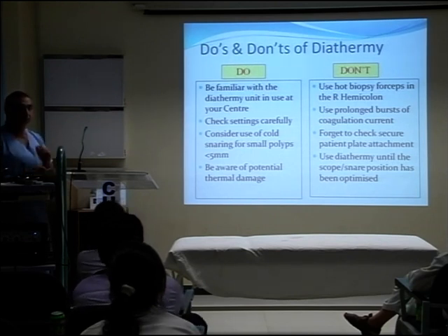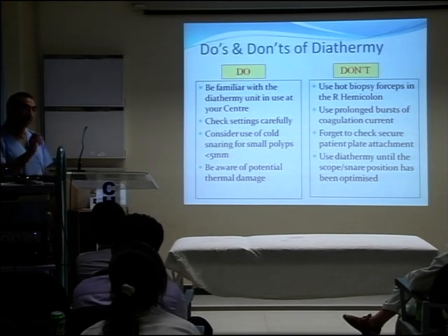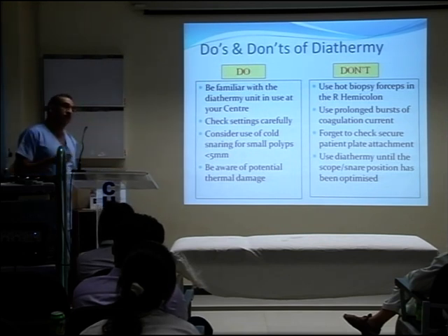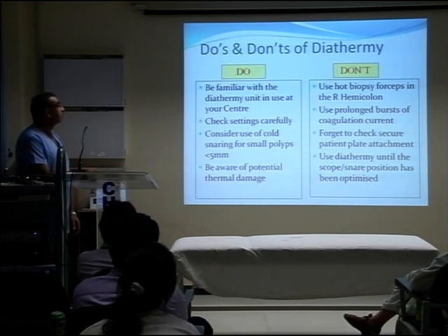That's why I keep on telling you 5 o'clock position. And the reason I keep on telling you to get the fluid pool into 5 o'clock position is for the same very reason, you need to practice that. Because you should be in control. You shouldn't be trying to do it from an awkward angle because that's where problems can occur. So always be in command.